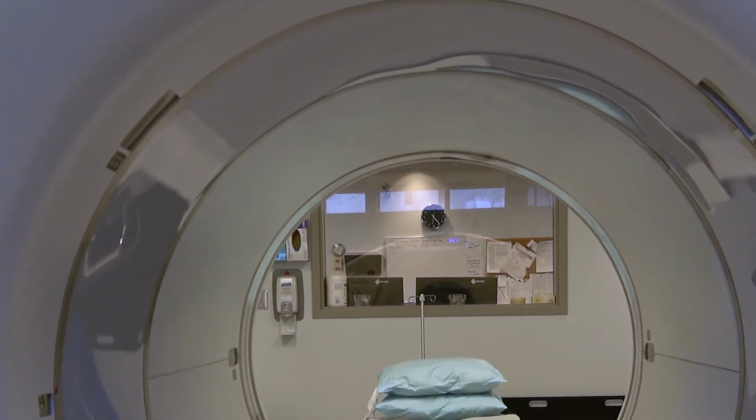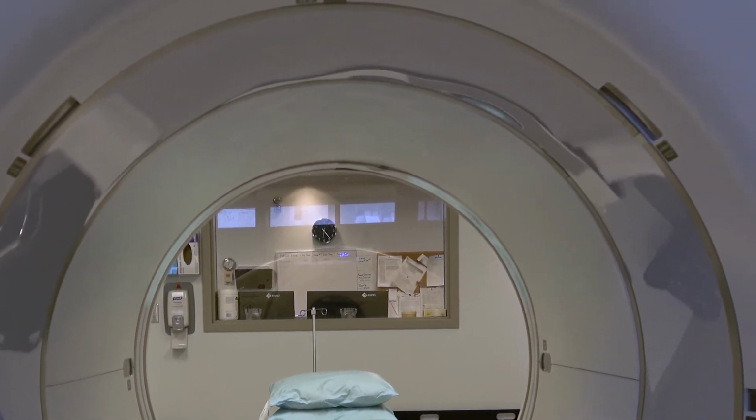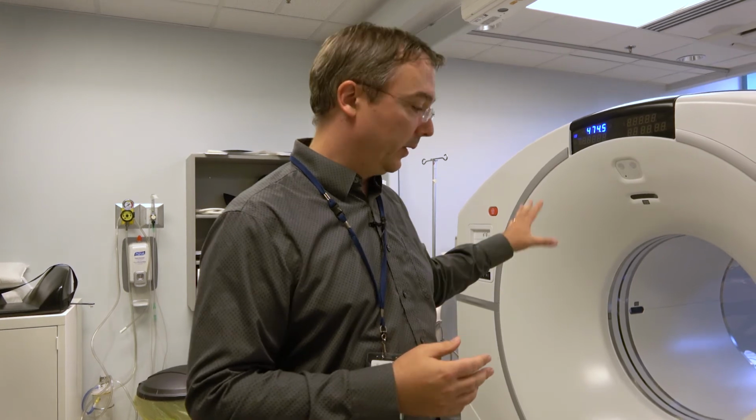And so the difference between the base model scanner that we could have purchased and what we were able to purchase because of the Foundation is that extra 10 centimeters of detector width. And that allows us to tailor the examinations, do the examinations faster, and basically customize the test for the patient's needs. So it's a really cool instrument.